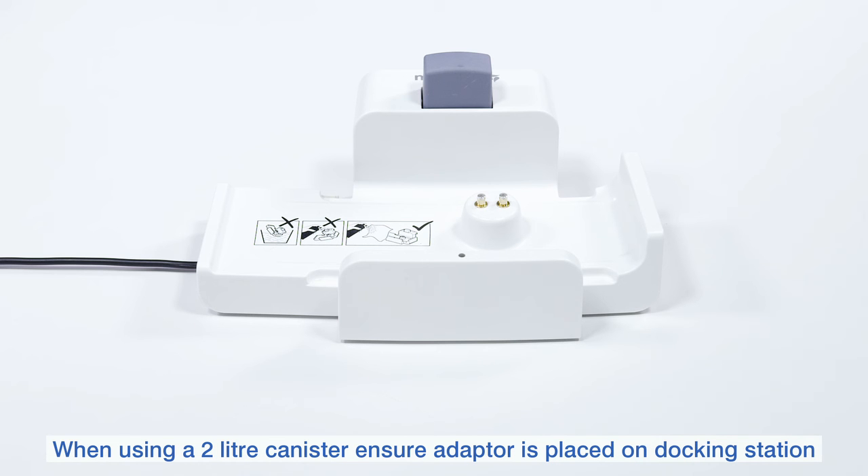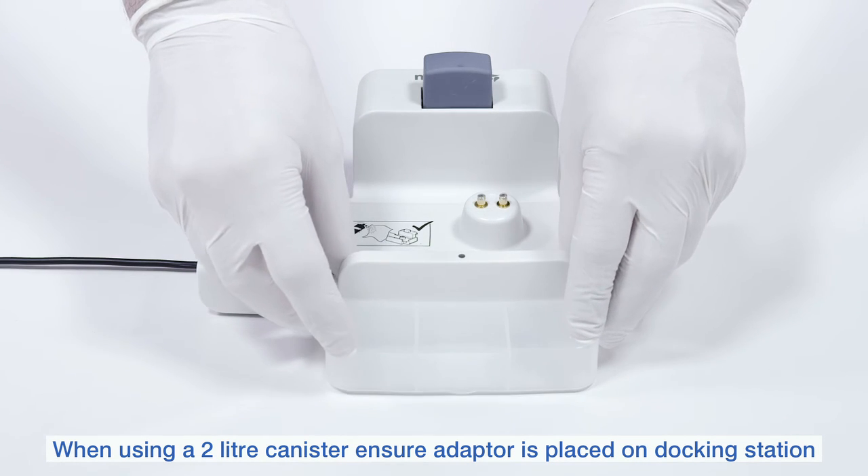When using a 2.0L canister, make sure that you attach the adapter to the docking station.